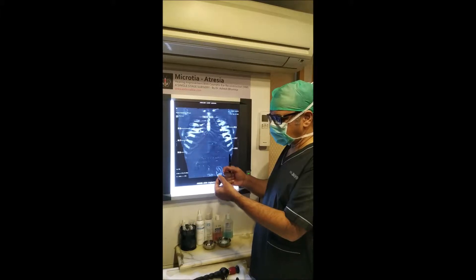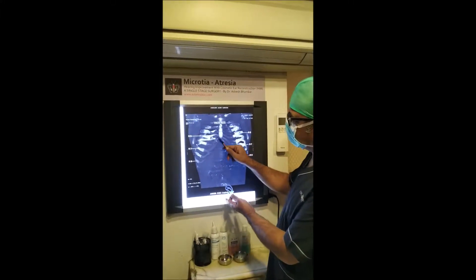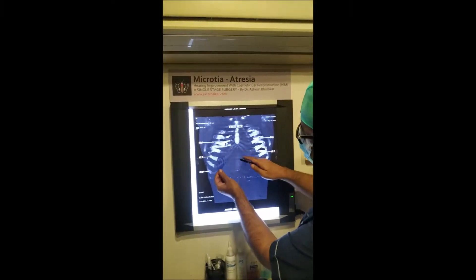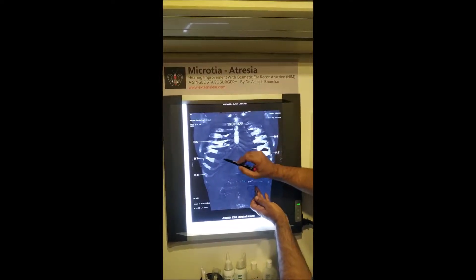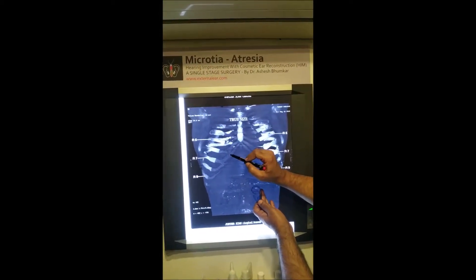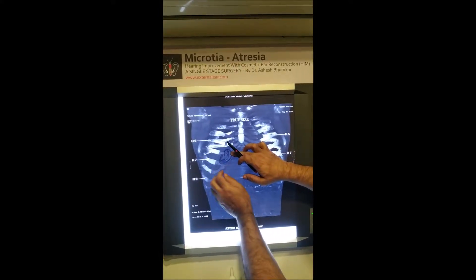This is the CT scan of the chest with the cartilage shown at true size — the actual size we will get when we harvest. Comparing right and left sides, I think the curvature of ribs 6 and 7 on the right is much better, so we have decided to use the right side and harvest from there.